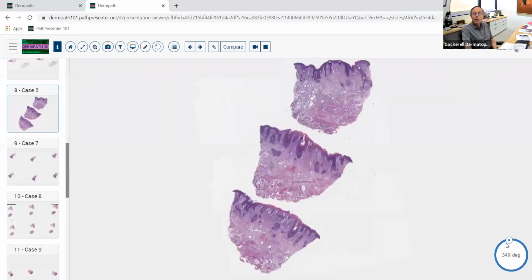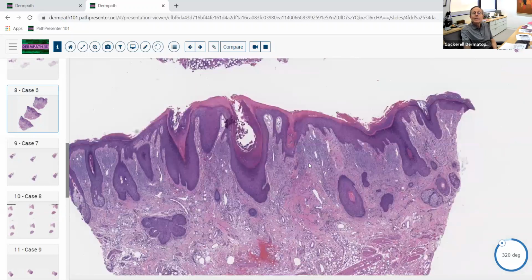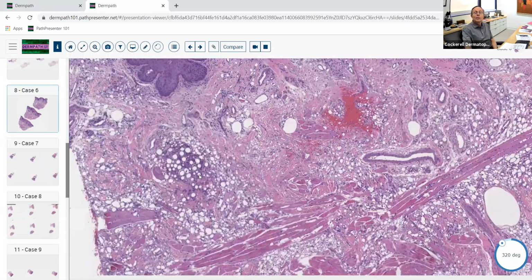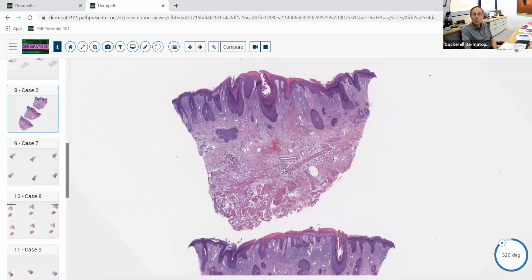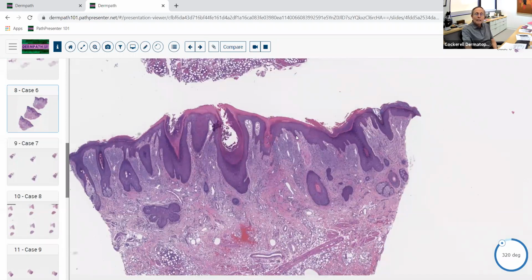This is another very common thing we're seeing today. Yeah, here it is, down in this area. Beautiful. I'm not sure what part of the body it's on, but it's an area where there's a lot of muscle and some sebaceous glands. It looks like volar skin when you first look at it. You say, gosh, look at all that thick cornified layer. It looks like it might be from near the palm or sole, but no, it's not. This is actually because the person is rubbing it.